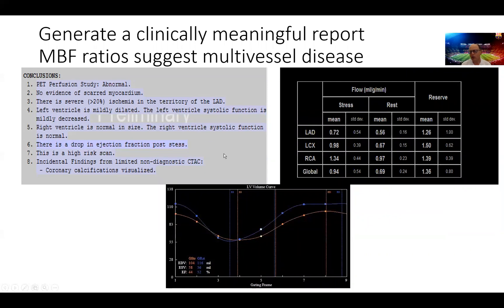So this is how we interpret the study. This is more than 20% of the ventricle was ischemic. We have a drop in ejection fraction, high risk scan.